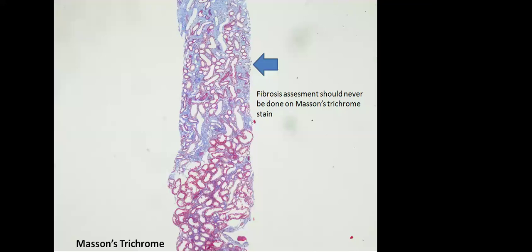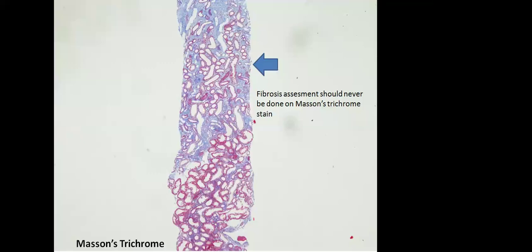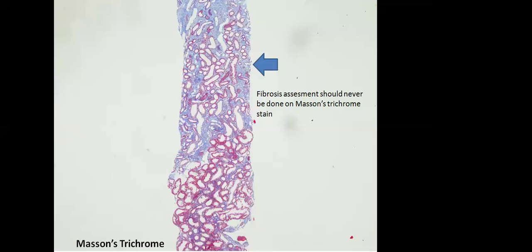We should know the basic stains used in kidney biopsies. Hematoxylin and eosin stain is very good to interpret what kind of interstitial infiltrate is present - whether it is lymphocytes, plasma cells, eosinophils, or neutrophils. Masson's trichrome and PAS stain is good to comment on glomerular morphology, tubular morphology, tubular basement membrane thickness, and brush border.